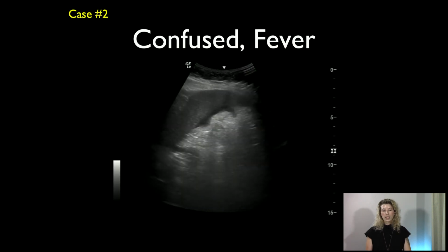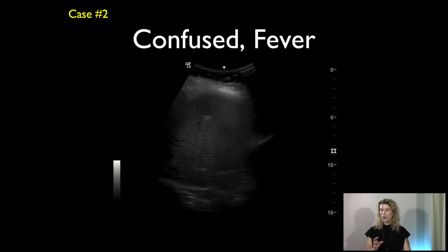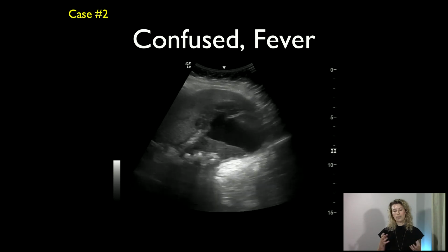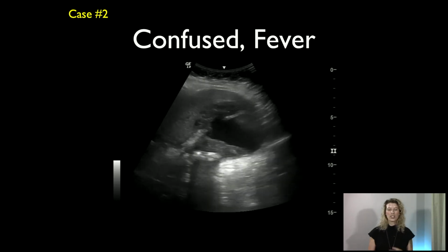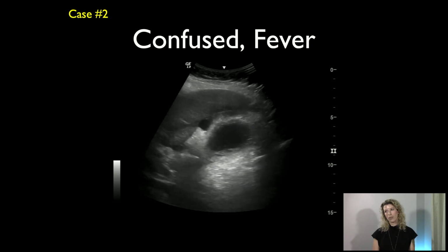So I'll put this clip back up to explain it. In this particular patient, the area around the gallbladder is so edematous, and, we all use our special little words that we have as emergency physicians, so I'm gonna say ratty. It just looks so awful that I would be concerned that we missed something like a gallbladder perforation.